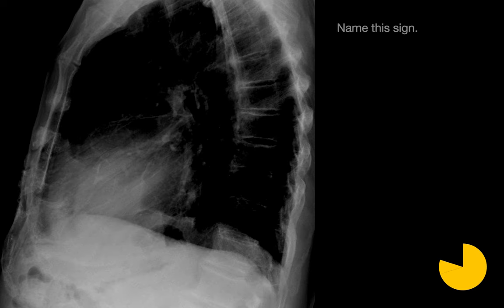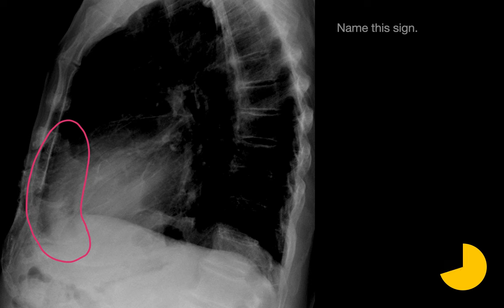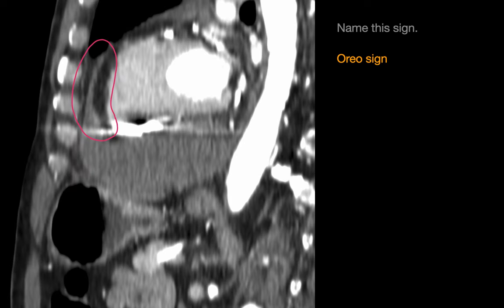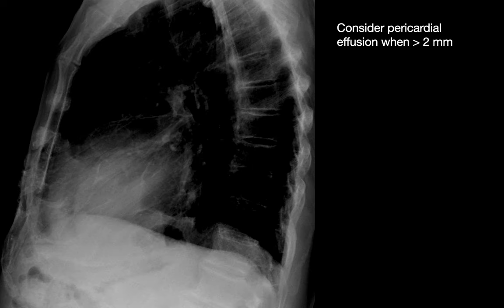Name this sign. In this case we see three parallel bands — two that are lucent and darker, and one in between that's whiter and more opaque. We refer to this as an Oreo sign because it's supposed to remind us of the way an Oreo cookie looks on its edge. This is better illustrated on a sagittal CT image. We think about pericardial effusions when we encounter an Oreo sign.